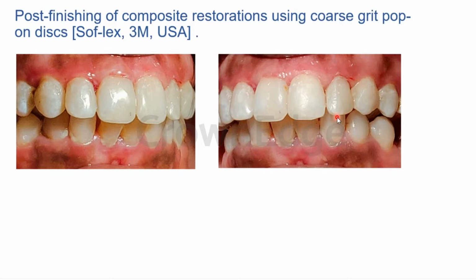So it is apparently important for us to also understand the personality of the patient before we do these restorations, because each and everything we do affects their personality, is what visagism speaks about, right? So in this case, we gave smoothly curved incisal angles, and they were oval teeth, so it made a good kind of camouflage in order to decrease the length and make it look more broad.